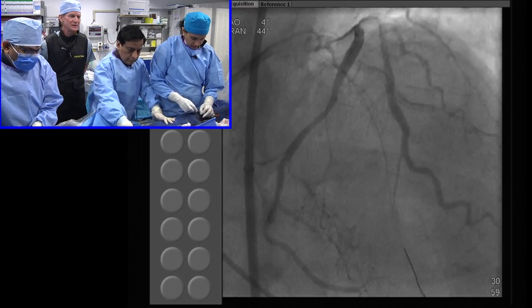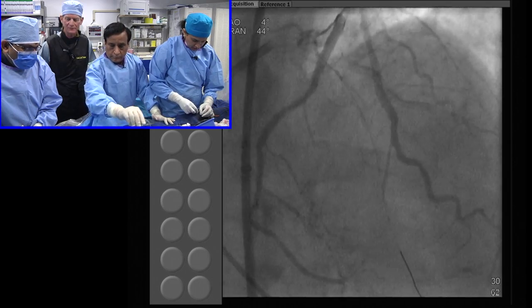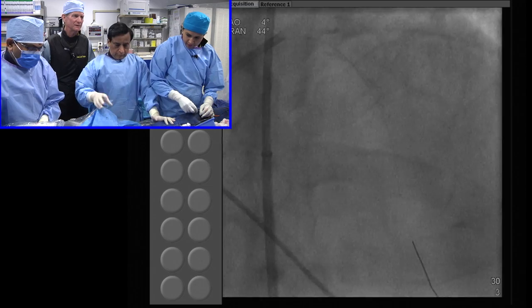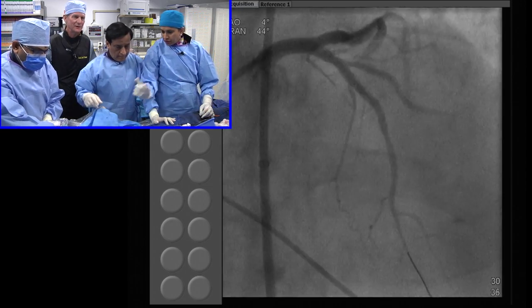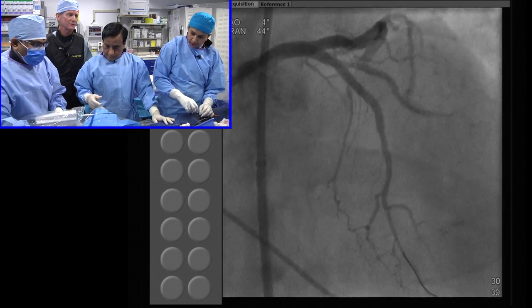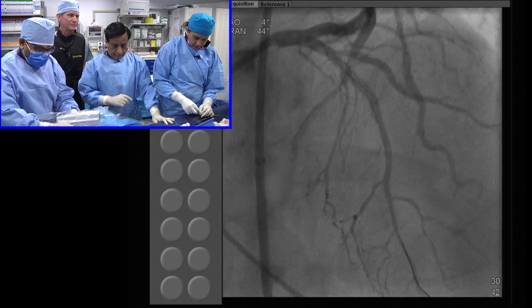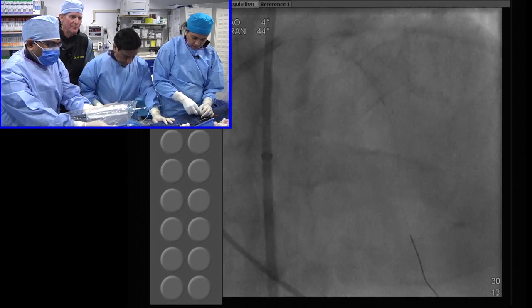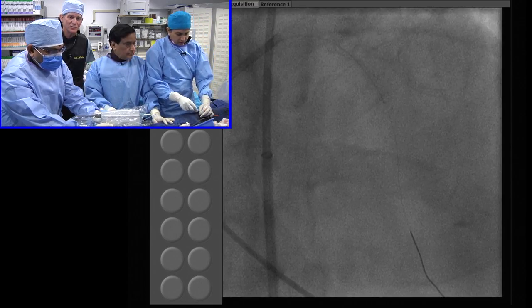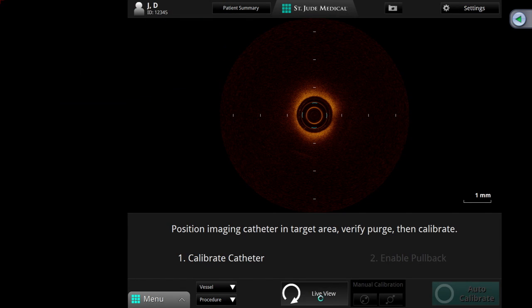But what our OCT data shows at 6 months is that the struts are fully covered. So if a patient had to come off DAPT after 6 months, it should be safe, although I have to couch that comment in that we don't have actual clinical data on that, but we have OCT data showing that the struts are covered in many, many patients in OCT studies. So if the patient had a bleeding episode on DAPT or needed to have surgery after 6 months, based on our OCT data, we would predict that it would be safe. But of course, we need to generate the clinical data.